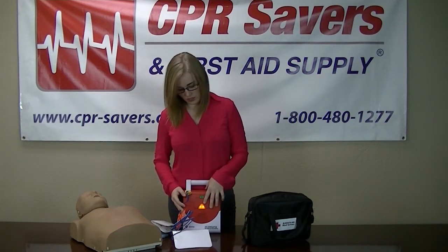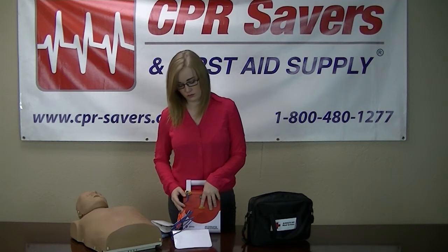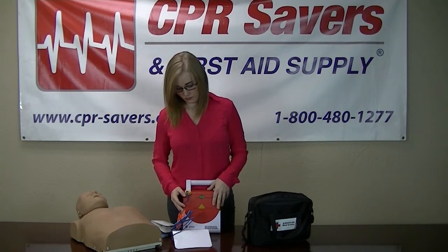Once your unit starts to beep, go ahead and press the blinking triangle. Shot delivered. Begin five cycles of CPR.